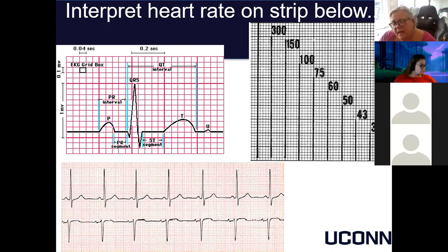And if you're on a telemetry unit or an ICU, certainly telemetry, you have to document what the telemetry is showing with these numbers at various points throughout the day. Whether it's done by a monitor watcher or the nursing staff depends on the hospital's policy.